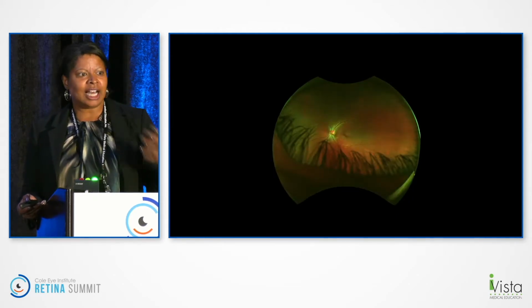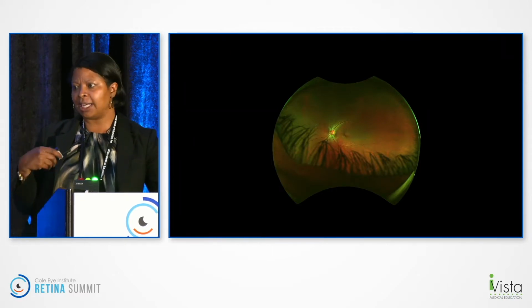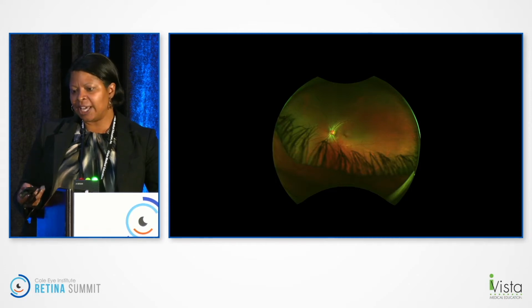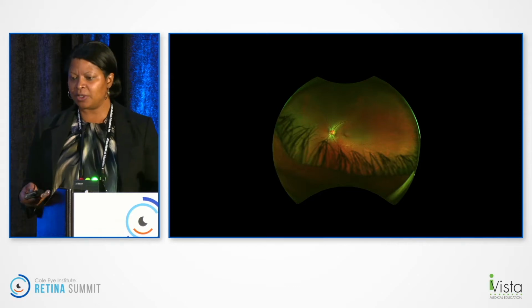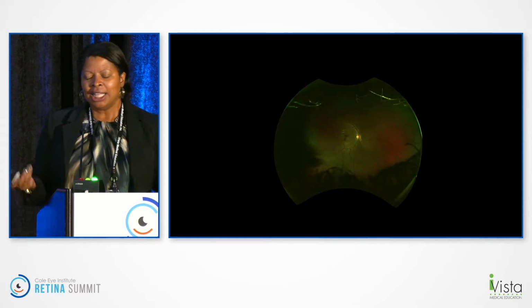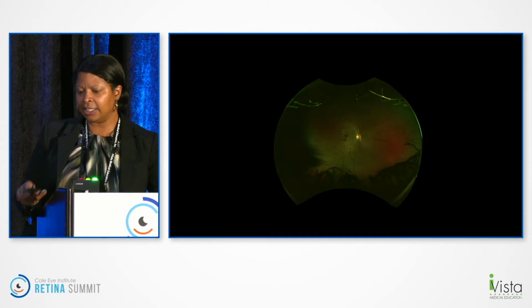But then there's a lot of images that came back like this, okay? So these are, again, my study team taking these pictures, and this is a picture that, for example, we would reject from the study because we don't really get to image or see most of the retinal periphery here. Who's to say there's not some horrible lesion underneath the inferior retina that we're not capturing? This, for example, is not an acceptable image. It's dark, it's out of focus. There's something over here in the corner we don't know, too much lash artifact.